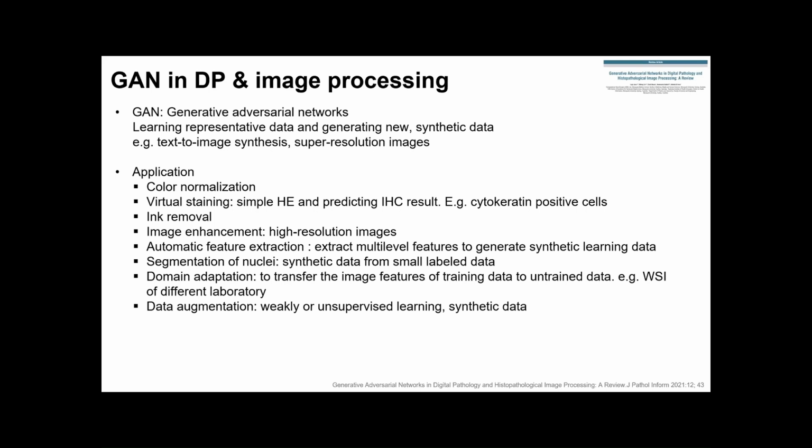It can be applied in pathology data to color normalization and make a virtual staining, such as making simple H&E and predicting immunohistochemistry from the H&E slide.